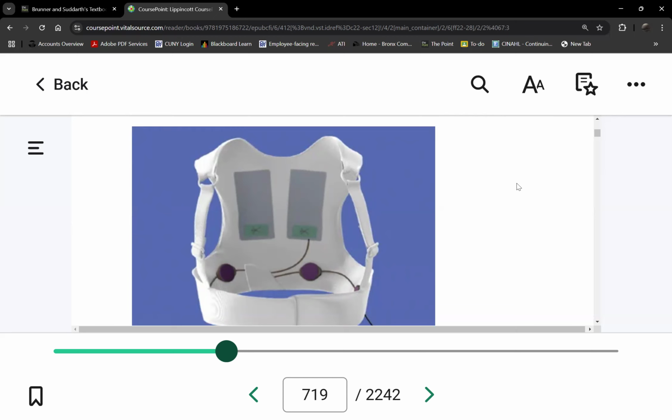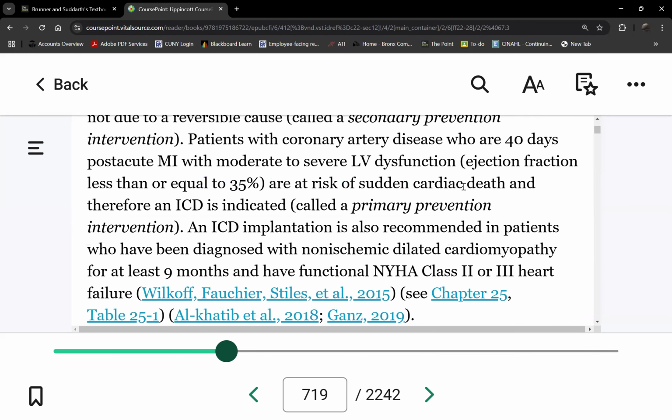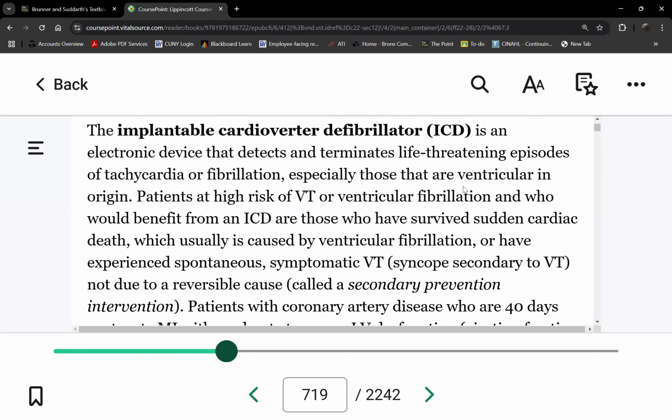The admissions, they have an issue that they need to wait to get it. Correct. So patients who we have indications here. Okay, so who gets an ICD? So here's the answer. Thank you for reading the first few sentences.